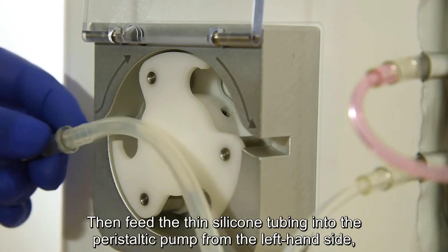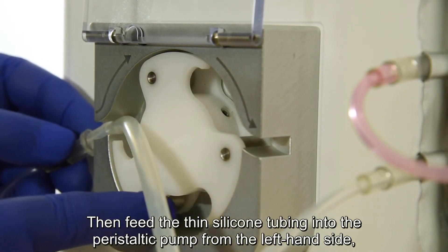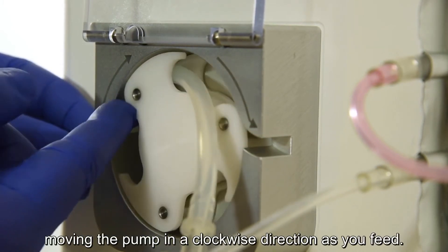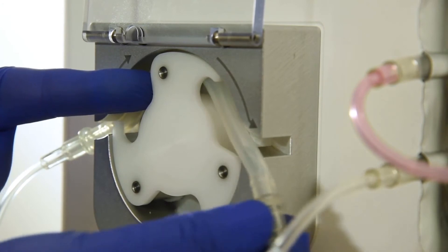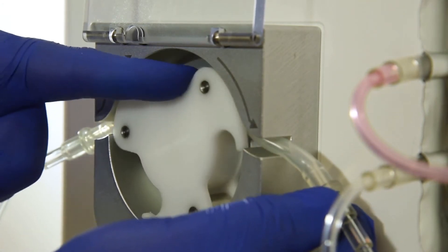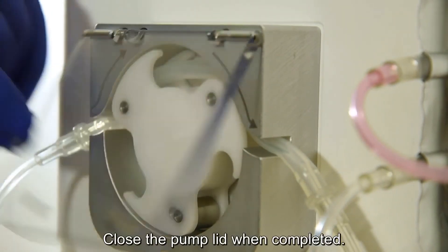Then, feed the thin silicon tubing into the peristaltic pump from the left-hand side, moving the pump in a clockwise direction as you feed. Close the pump lid when completed.